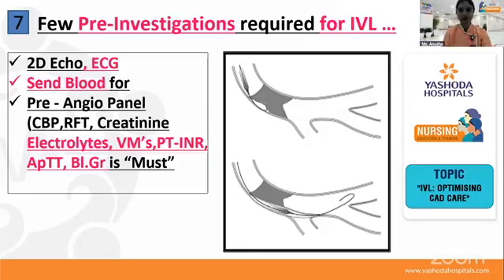So based on the deposition of calcium in the heart structures, you decide your catheter, which is 80 or 120, and that's how the breaking process starts during this procedure. Over to you, Anusha.